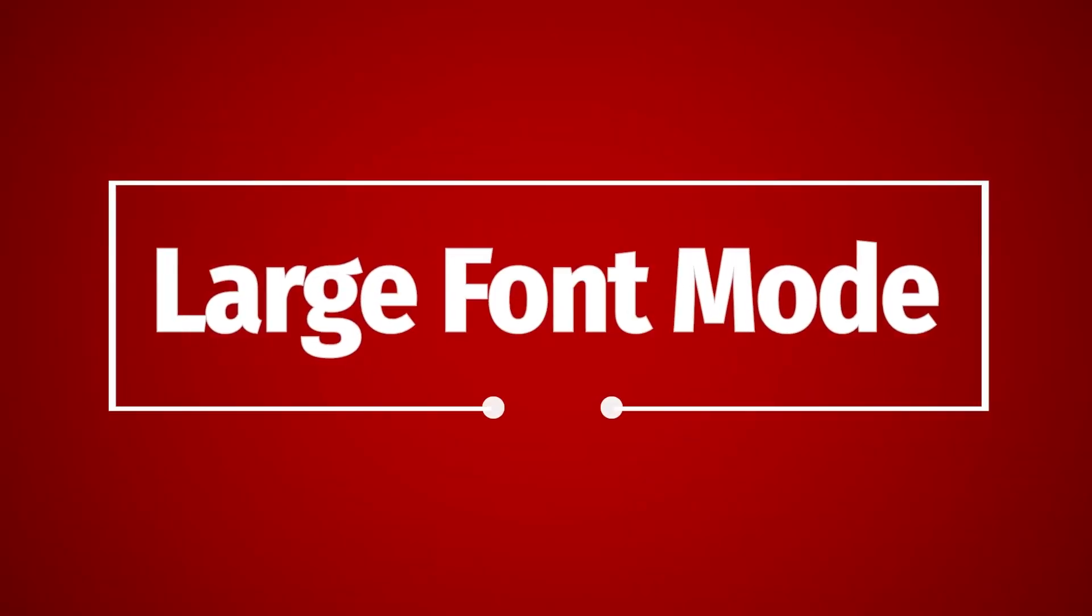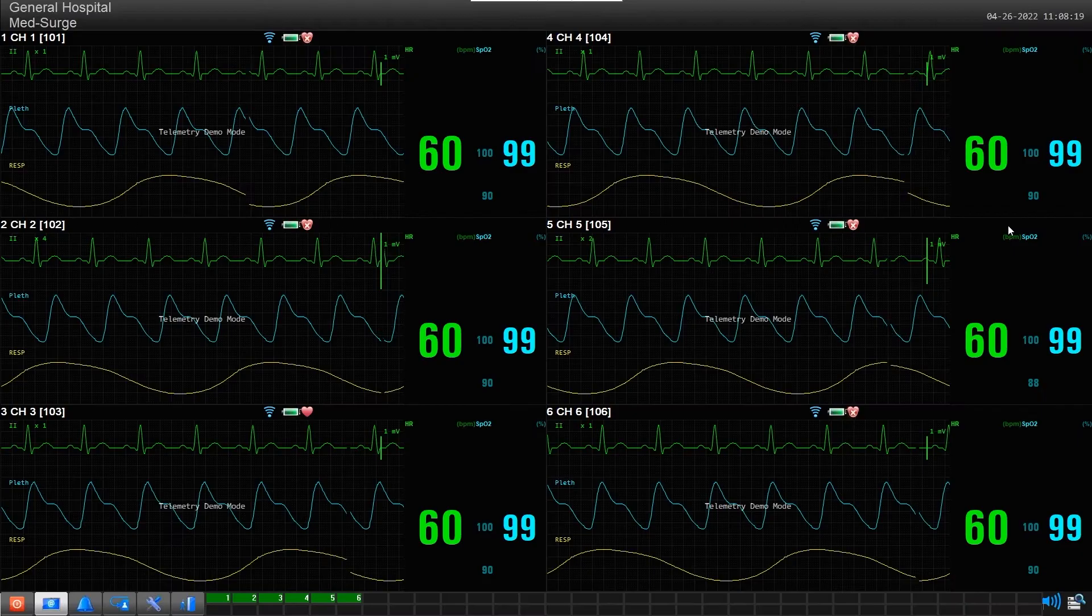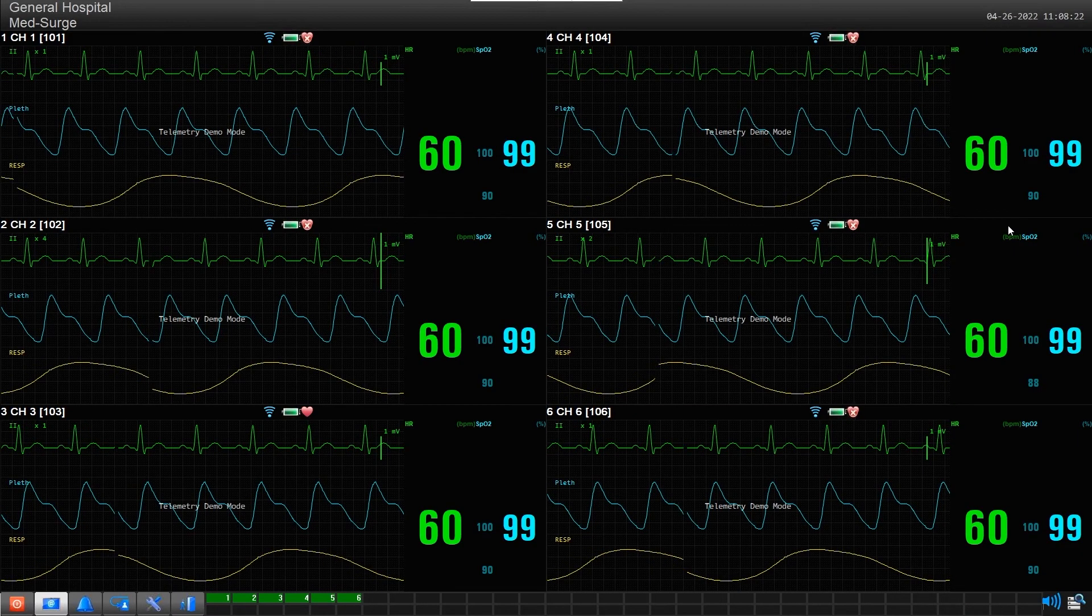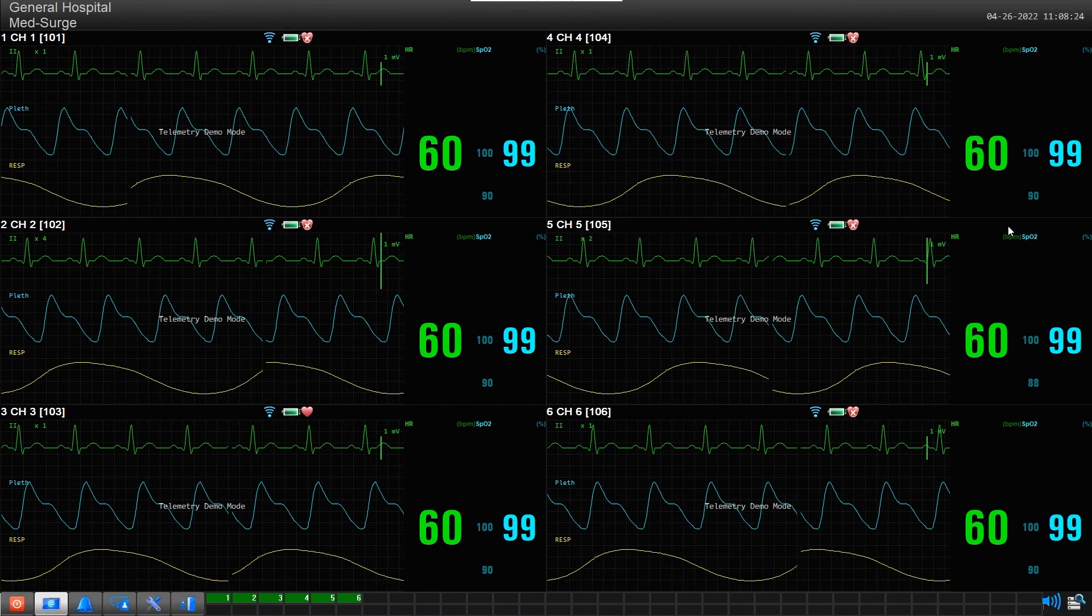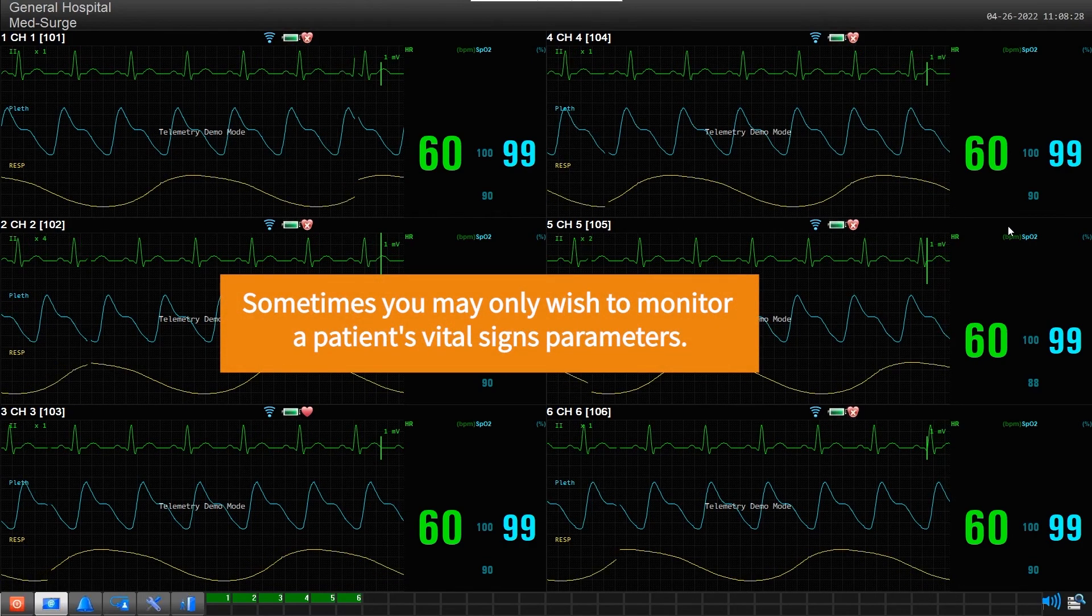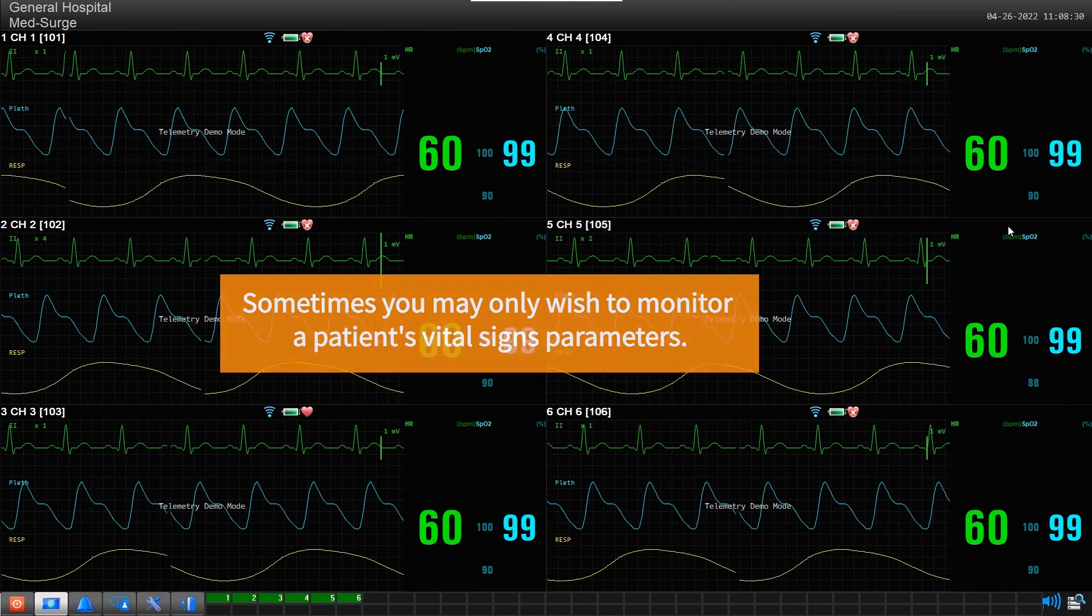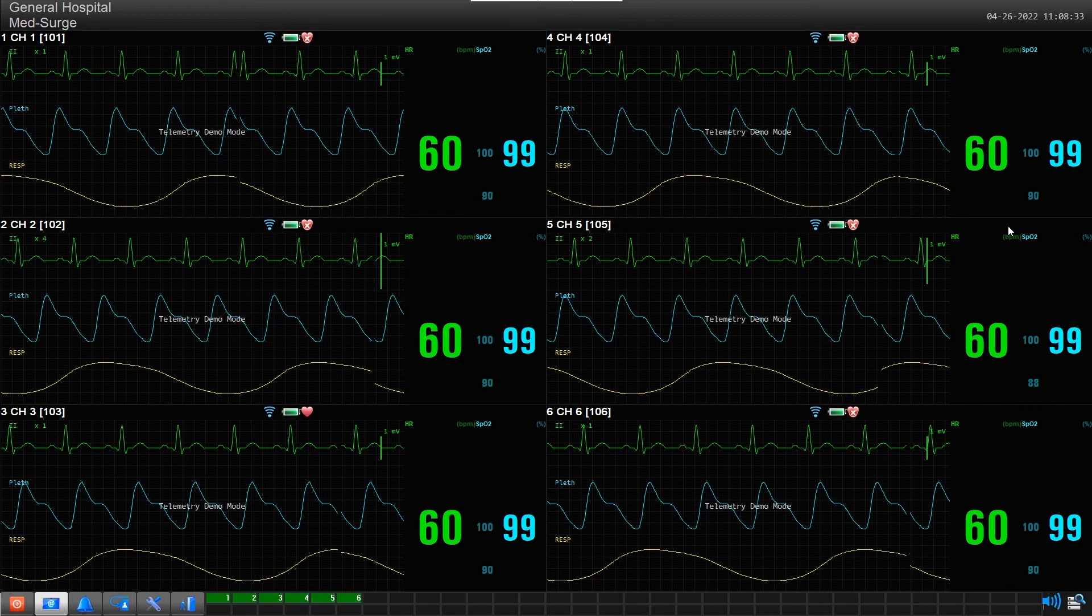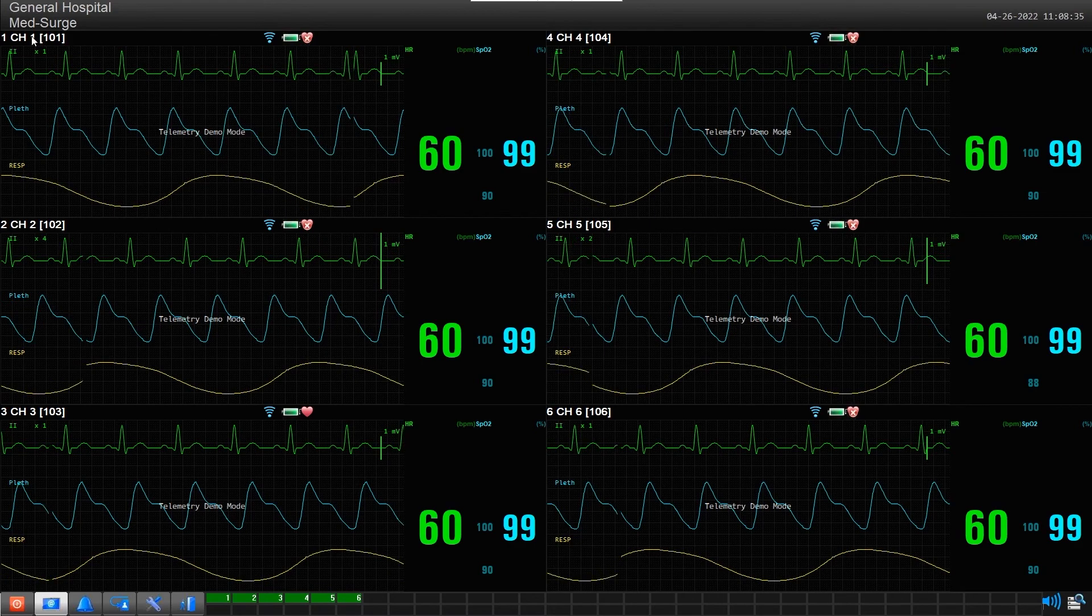Large Font Mode: Another great feature you should be aware of is Large Font Mode. While using Bedside and Vital Signs monitors, you may only need to monitor a patient's vital parameters. Large Font Mode enlarges these numbers, making them easily visible from across a room.